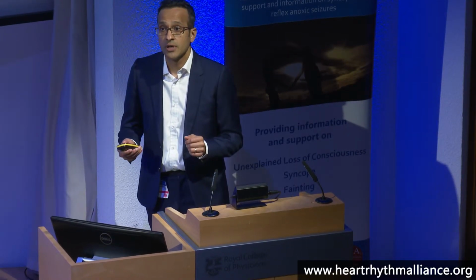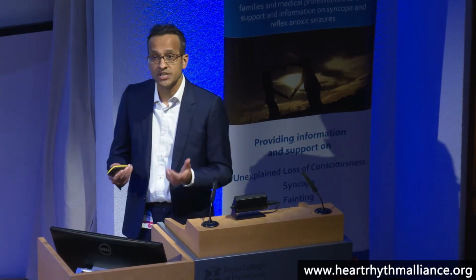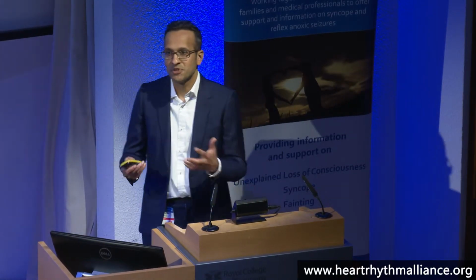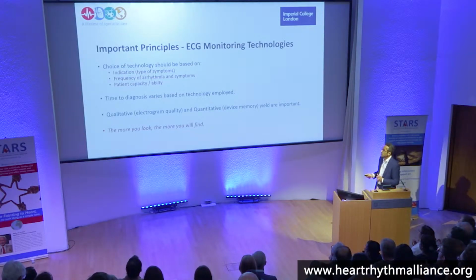As you heard earlier on, 2-week monitors are often prescribed immediately after presentation. And also the patient's capacity and ability to engage with the device. This is something that you have to sort of gauge when you meet the patient. Just because the patient is 85 years old doesn't mean they don't have the latest smartphone available to them, okay? And same applies in a reverse way for young patients.